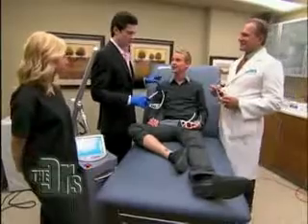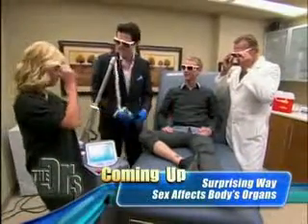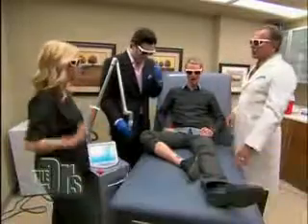I should preface this by saying most of my patients like to numb up. Josh has a really high threshold for pain, so we're going to move forward with no numbing. Absolutely not. Going into it. We're all good. Let's throw our glasses on. Okay. Nurse Sarah, we set with the laser? We're all set. Okay, Josh. And this is the Q switch laser.